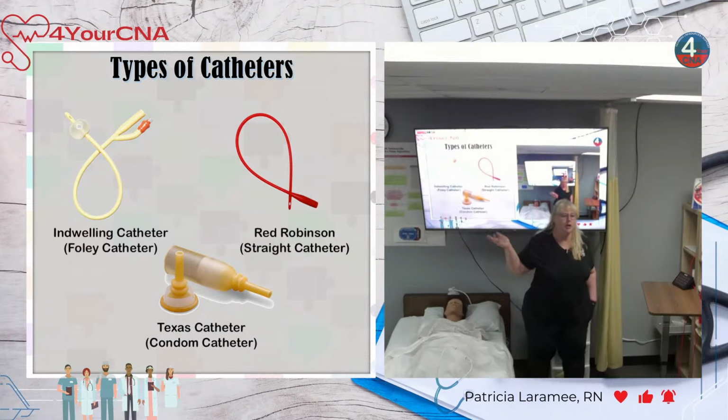I don't want to put another stay-in catheter because the whole point is we're trying to get your body back up and running normally. So I'm going to pull a let's-empty-the-bladder catheter out. We're going to put this in, empty the bladder, and measure it to see how much you're retaining. And I'm taking that out because I want your body to get used to peeing again, right? With a catheter, you're not going to have that. So this is a short, quick, empty, and be done.